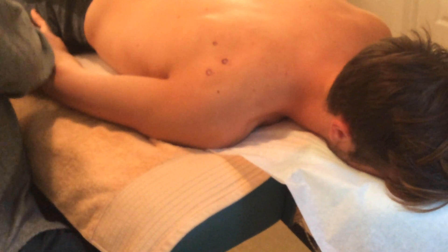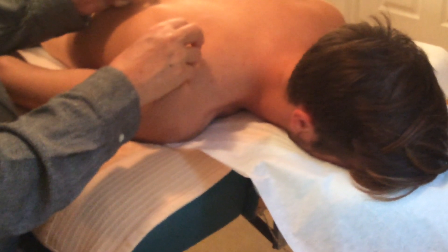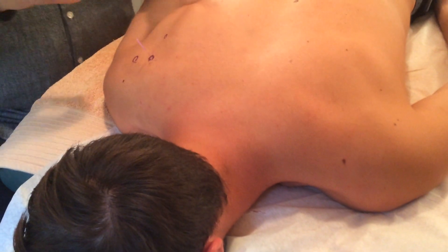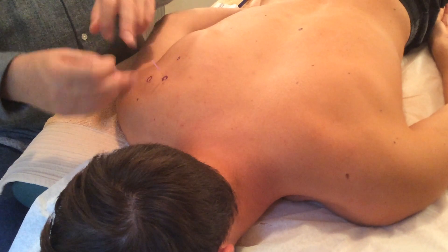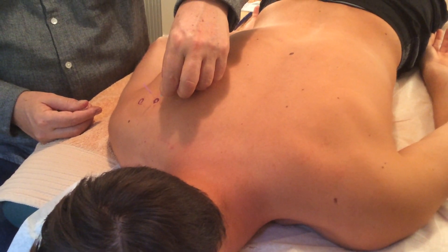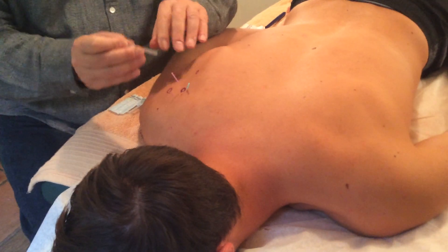I'm going to needle the infraspinatus. Do you feel that? In Chinese medicine this is called 'fishing for chi' — you put the needle in and move it around. I feel it's grabbing. Fishing for chi is when you move the needle around to get the tissue to respond. This is such a big point that I sometimes will then additionally needle it at an angle — we call this 'circling the dragon' in Chinese medicine. The dragon is the trigger point.